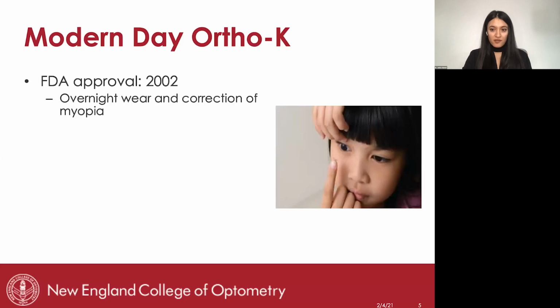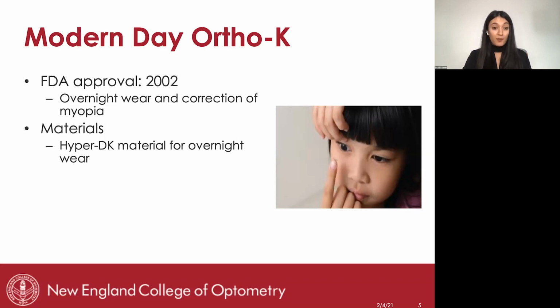Modern orthokeratology, on the other hand, allows the patients to wear the lenses during nighttime only, so overnight. And then the materials that we're using are FDA approved, and they're hyper Dk materials for overnight wear. Orthokeratology as well was FDA approved in 2002 for the treatment of myopia only.